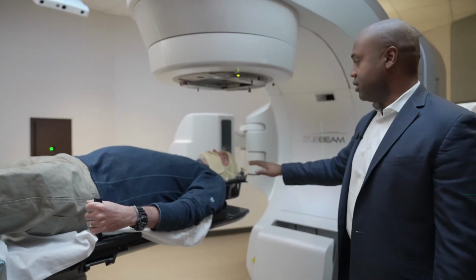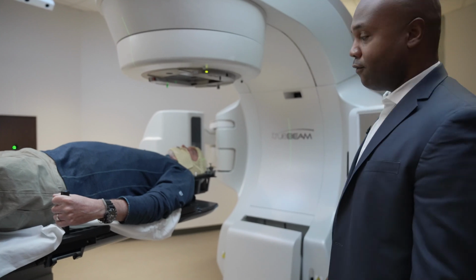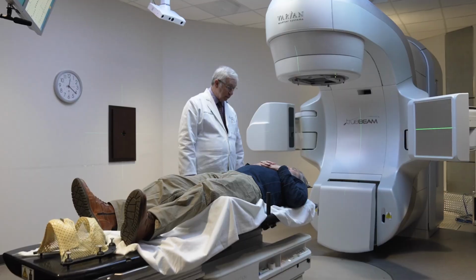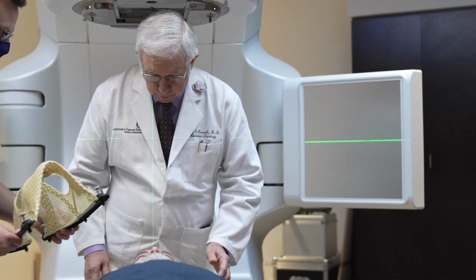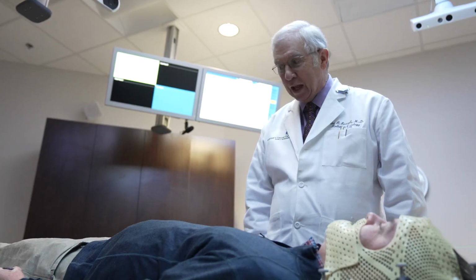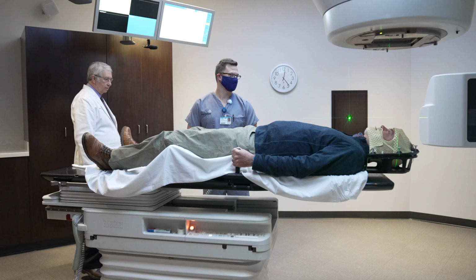So now that the patient is actually in the treatment position, now we'll bring out the imaging arms to prepare for the first set of imaging. Deep inspiratory breath hold is a way for us to take into account tumor motion caused by patients' breathing. With deep inspiratory breath hold, we are able to treat the tumor while decreasing dose to surrounding normal organs such as heart and lung. We were really excited to be one of the first hospitals as a community hospital to have this equipment, and we think it'll be great for patient care.